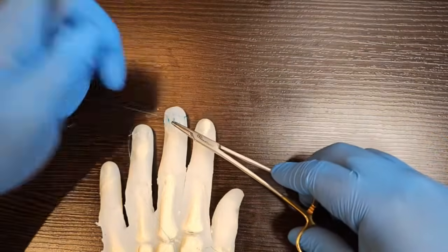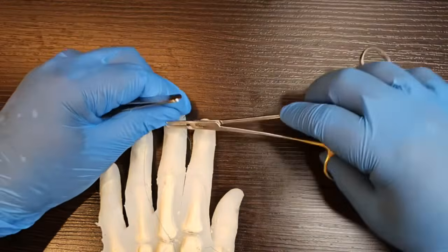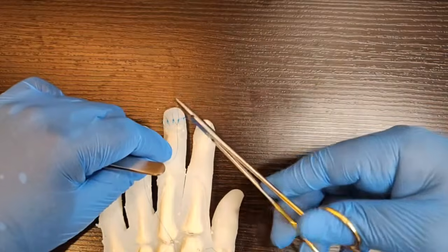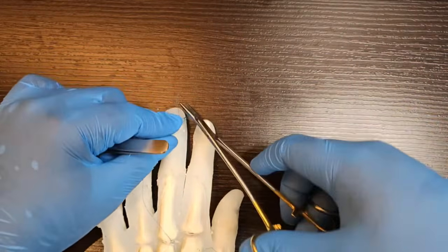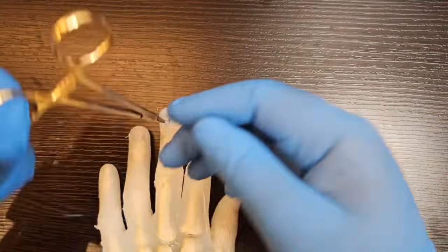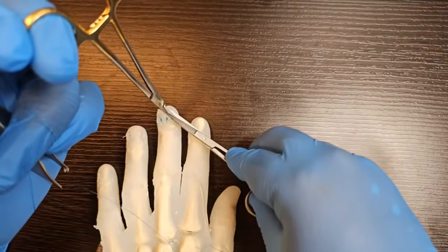The nail bed is very friable, so don't do anything under a lot of stress and tension. Let your needle body rotate through, and don't tie your knots too aggressively. Our good old trick here never fails.